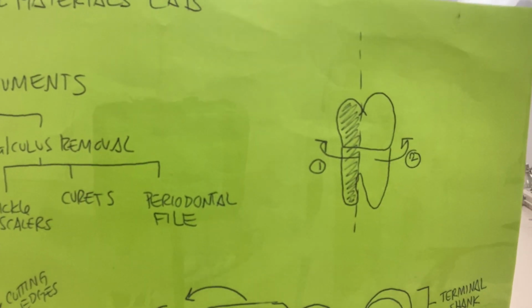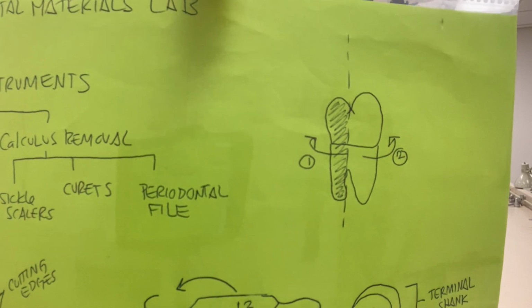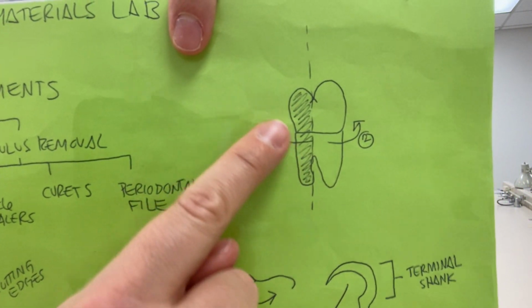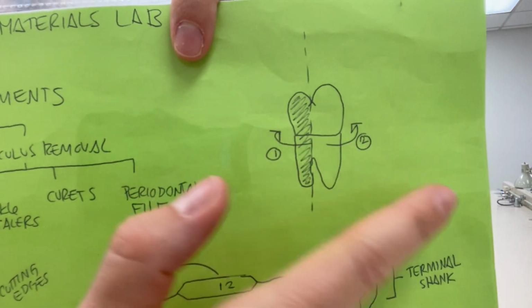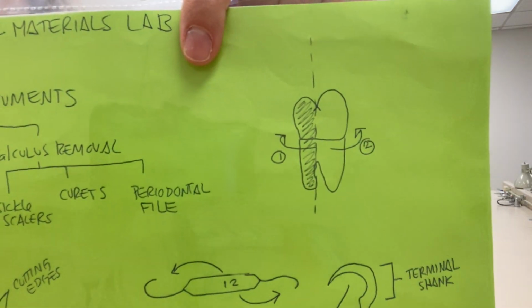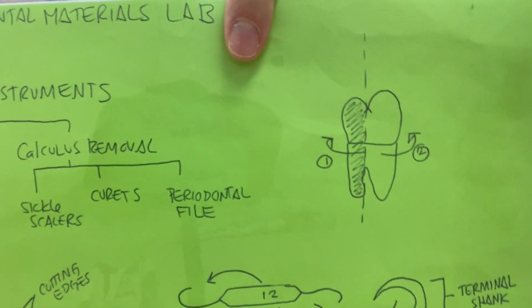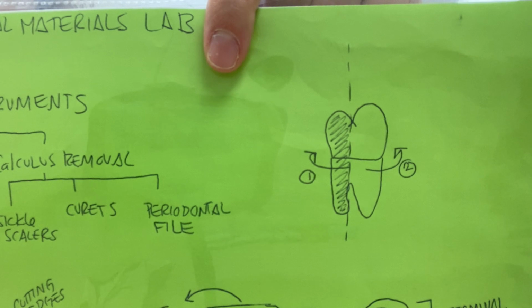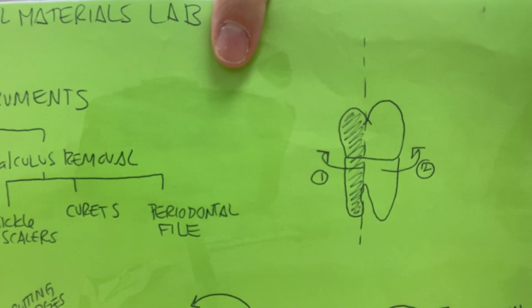And then we're going to divide the tooth just like we have been with exploring and probing. You're going to start on that distal line angle and scale in, come out, and then go across the front and then scale into the mesial. What I do want to call your attention to with this one is we don't do walking strokes anymore with scaling instruments. We are going to insert appropriately, adapt, and then scale, but we don't walk with these.